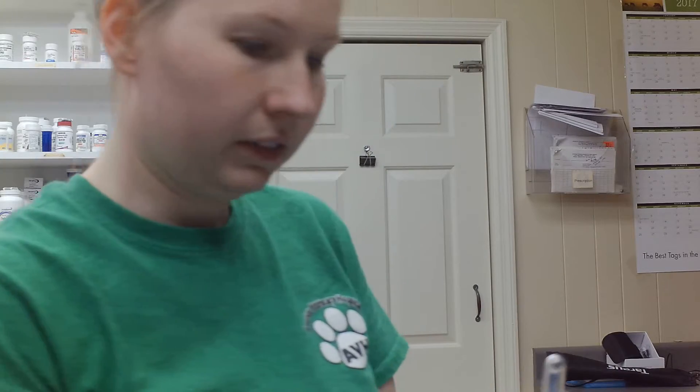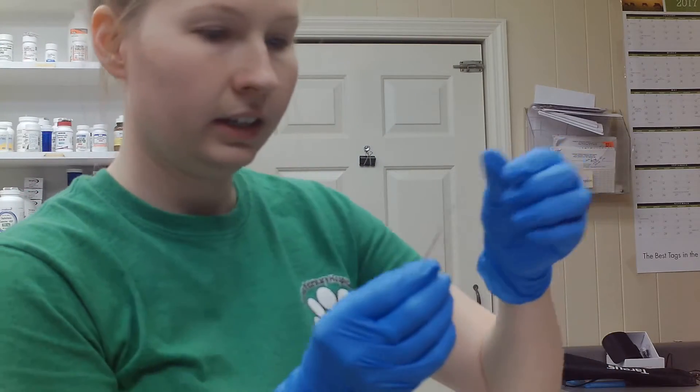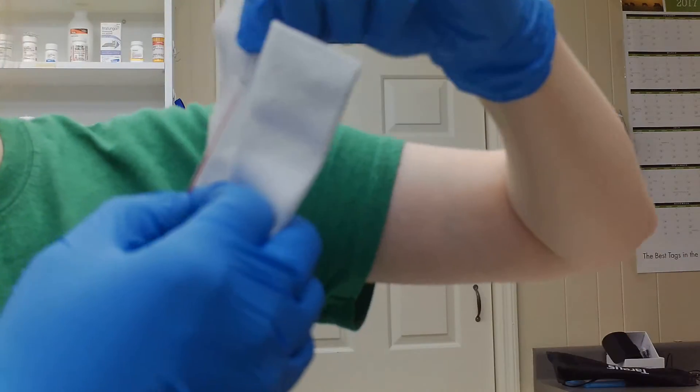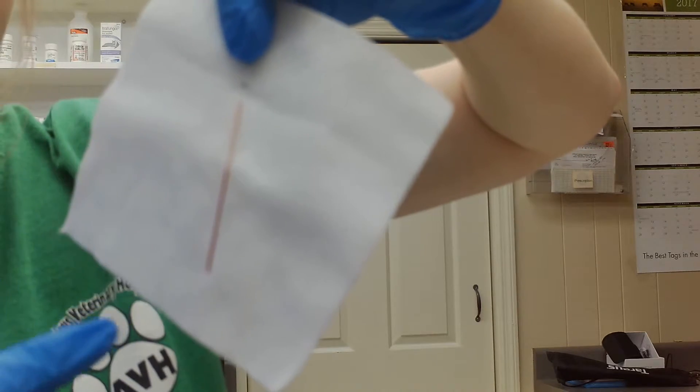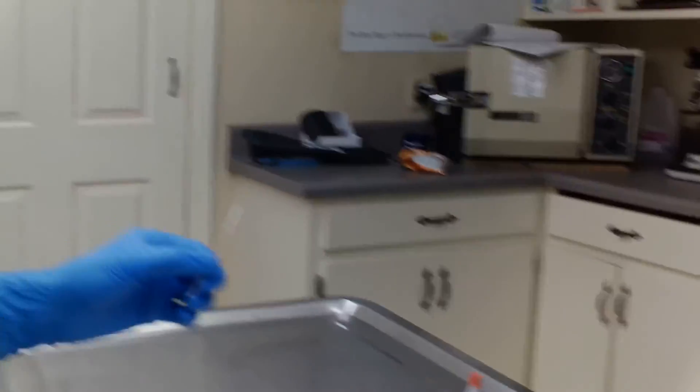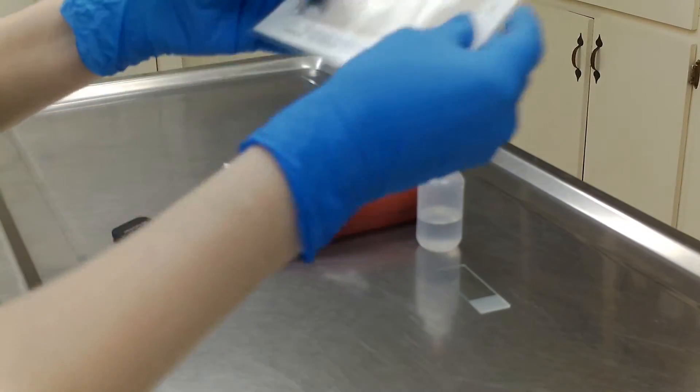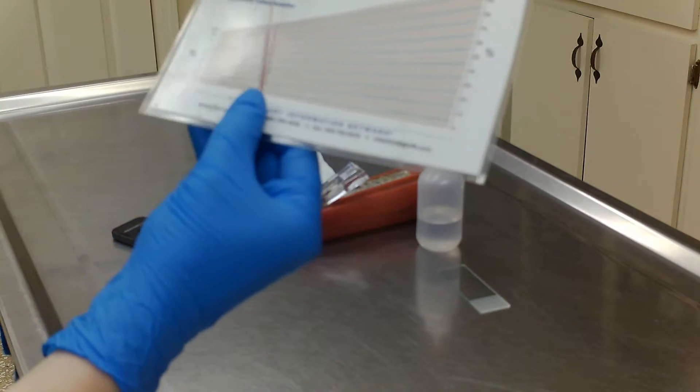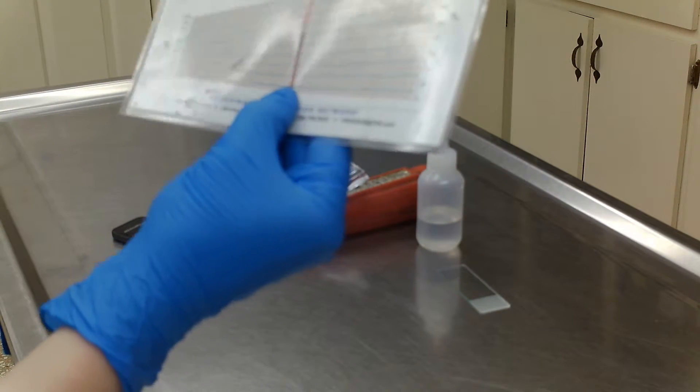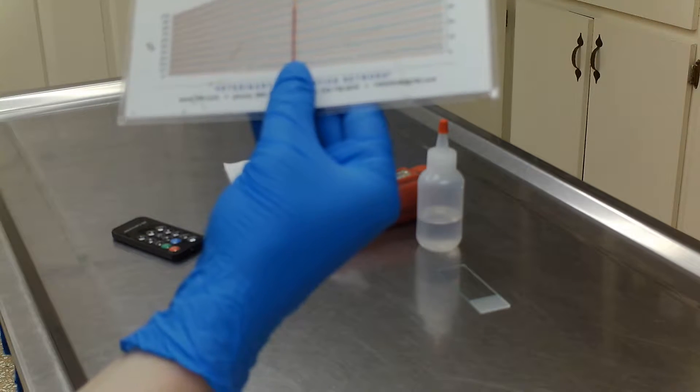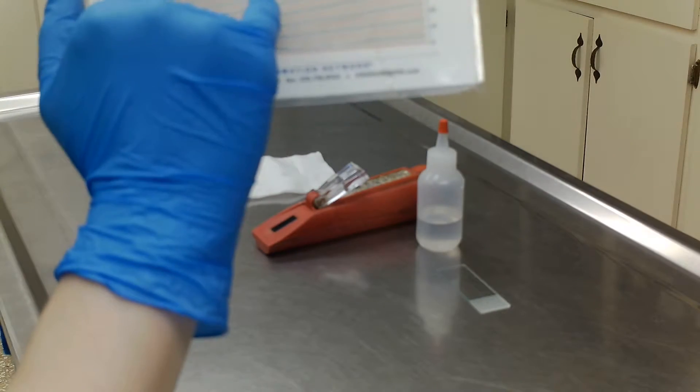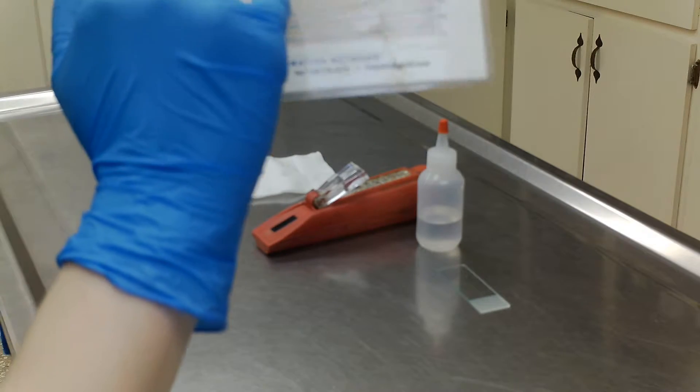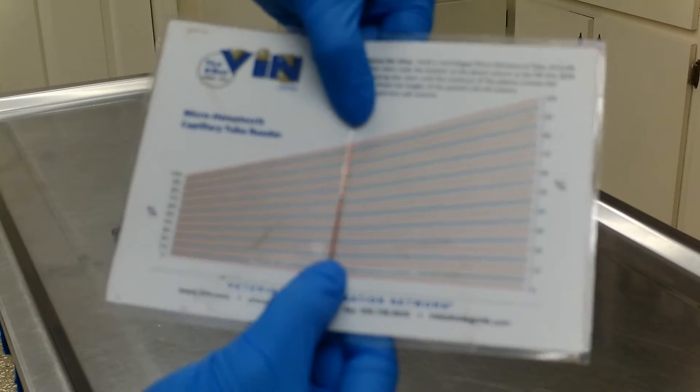I have to get it out of there. So we can actually see where the serum is here, a little buffy coat, and then all the packed cells at the bottom. So what we do, we're going to measure from the top of the clay at the bottom to the top of the serum. And I've measured about 64 percent, which is really good actually.